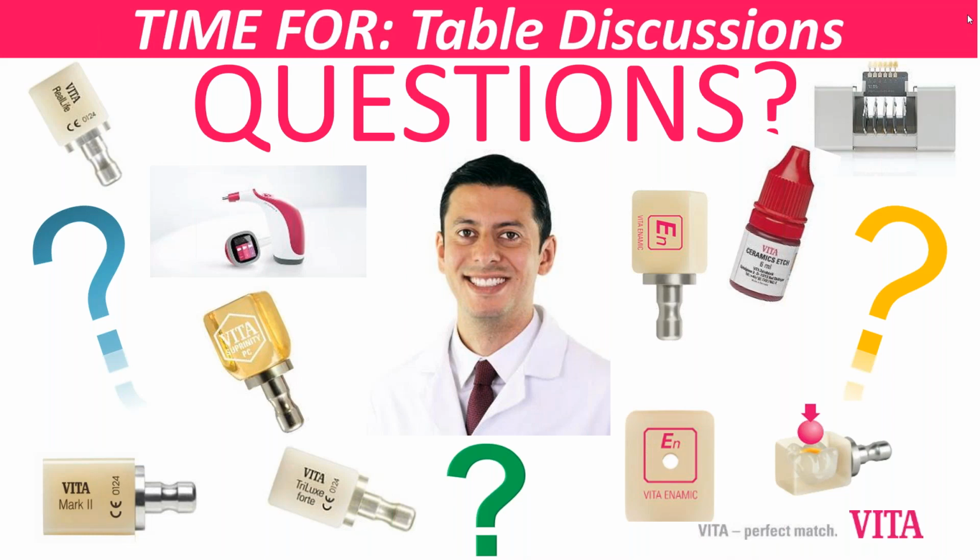For VITA, the numbers are 1 minute, right, Jim? It's 1 minute for Enamic. Yeah, 60 seconds, and 20 seconds for Suprinity. Yeah, exactly. So I would say you could be in that range between 60 seconds and 120 seconds, 1 to 2 minutes. But there's really no need to take longer.